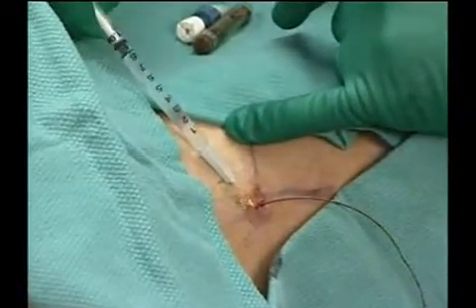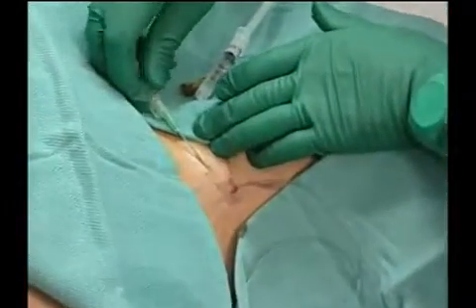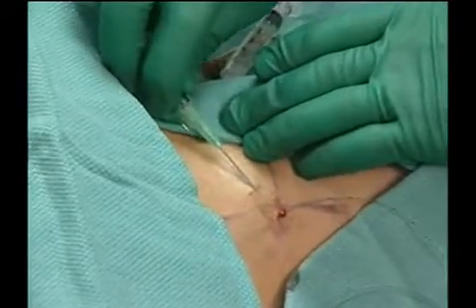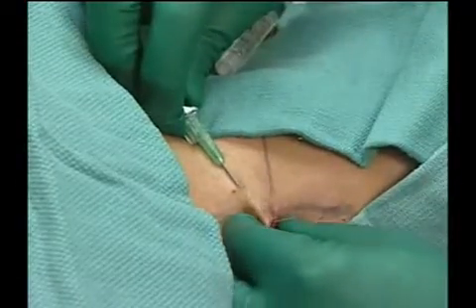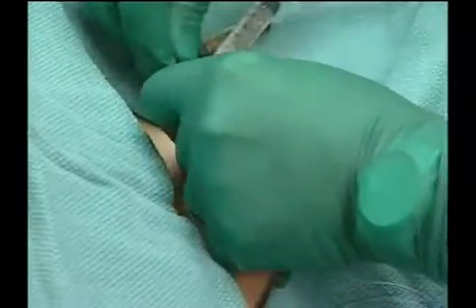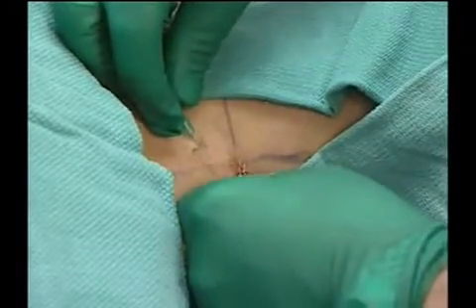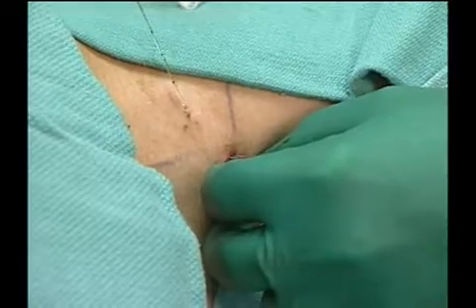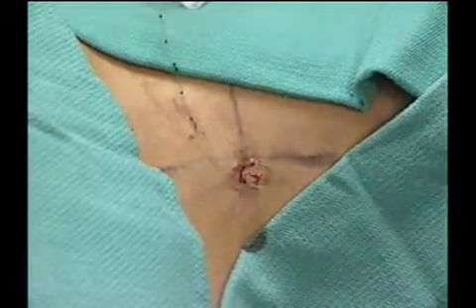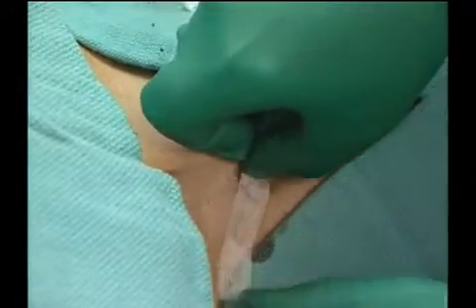Some local anesthetic is injected subcutaneously, followed by the placement of an 18-gauge intravenous catheter. The needle guide is removed and then the catheter is tunneled. Steri-strips and Tegaderm are placed to secure the catheter.